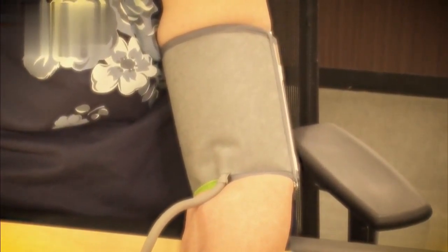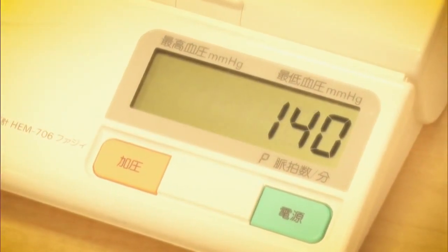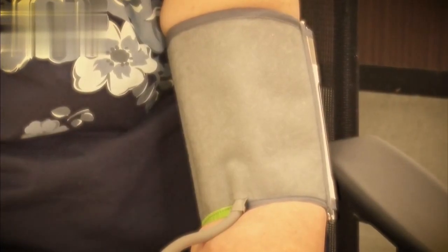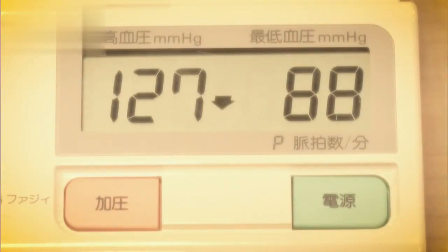As the pumps whirred to life, the cuffs inflated with air. If the pressure was too strong or too weak, it would mean failure. The team held their breath as they fixed their gaze on the machines. And then, correctly measured blood pressures displayed on both screens.